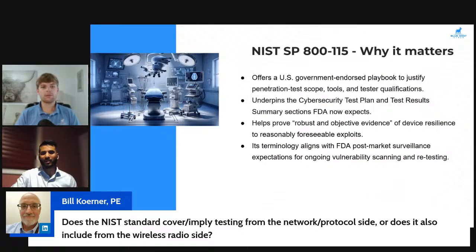So it goes back as a risk item, and you need to demonstrate what those risks are if you haven't identified them yet. It should have been something that was captured in your threat modeling early on. But if it wasn't, and it was detected during your penetration testing, that means the testing's working, for one, and that you need to add it back into your risk management process as a risk item or a risk ID, a risk analysis item that you need to figure out.